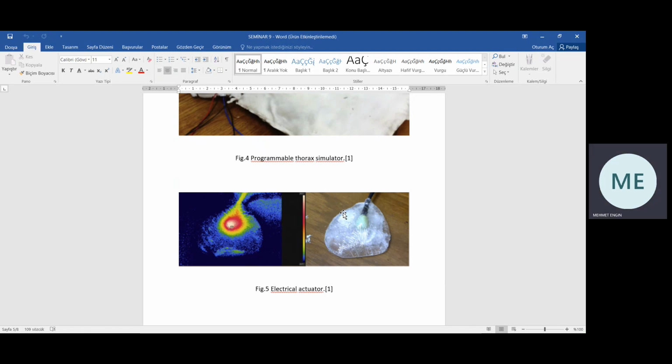The thermal spots were located and minimum, maximum, and average temperatures were observed. This process was repeated for the thorax thermal image. The temperature gradient between the highest temperature within the thermal spot and the temperature in the adjacent thermal spot area was determined.